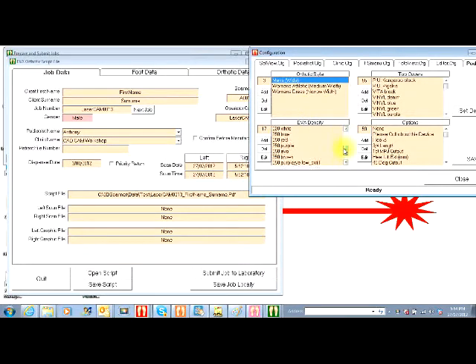I currently carry 19 different grades or colours of EVA. For every lab that'll be different, so they just add and delete what they need there. I have some 48 different top covers that I use. So you take out the ones that you don't use and put your own in.